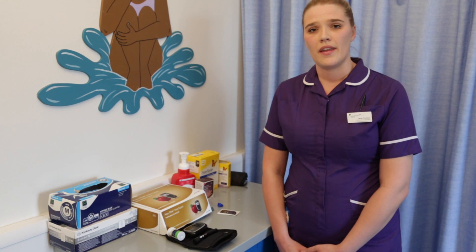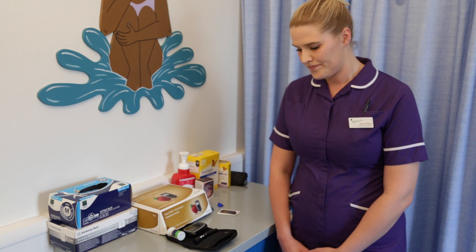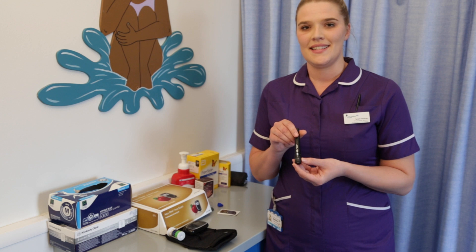First I am going to demonstrate the kit to you and then I will do a demonstration blood glucose check. For this I am using the AccuCheck Expert meter and I am using their FastClicks lancet.